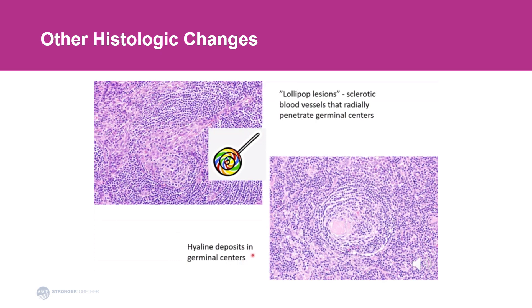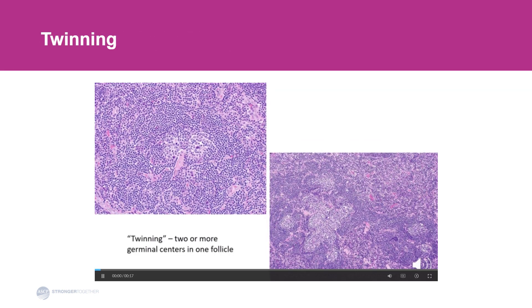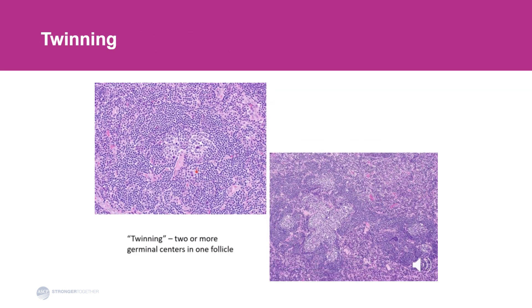In some cases, you can also see hyaline deposits — hyaline meaning pink — which is one of the other features of Castleman disease. Something also pretty characteristic is twinning, which is two or more germinal centers found in one follicle. Here we have two, and here we have multiple germinal centers which are conglomerated. Typically, you only have one germinal center in a normal lymph node.